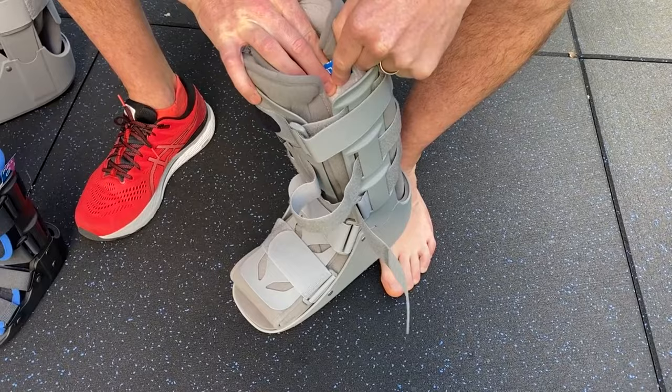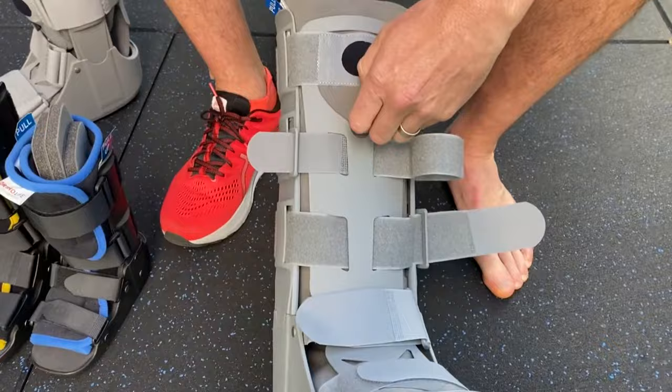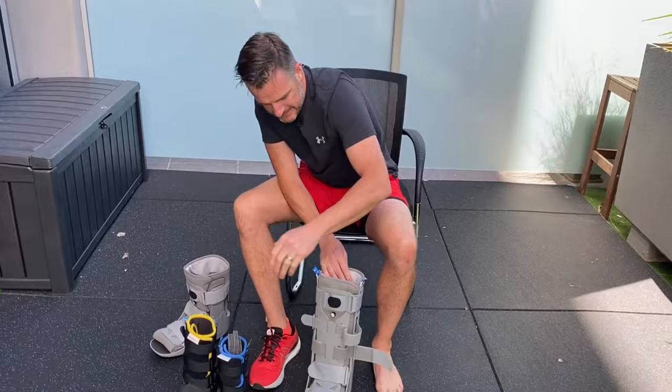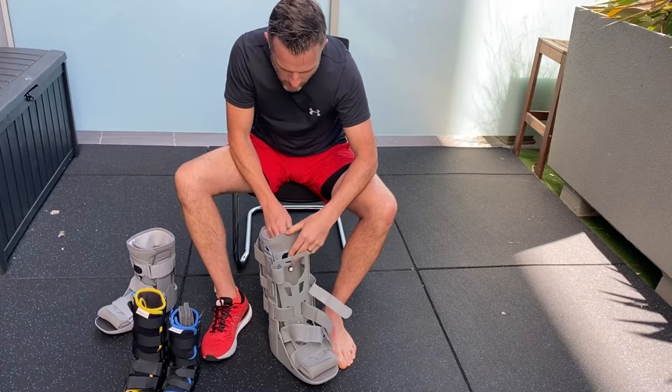The boot also comes with two protective strips you need to pull out — they're just protecting the velcro from the padding, so ripping those out means everything will stick together properly. Make sure you deflate the boot first using the inflate/deflate valve — open it up and let all the air out before putting it on. Don't worry about the pump just yet.